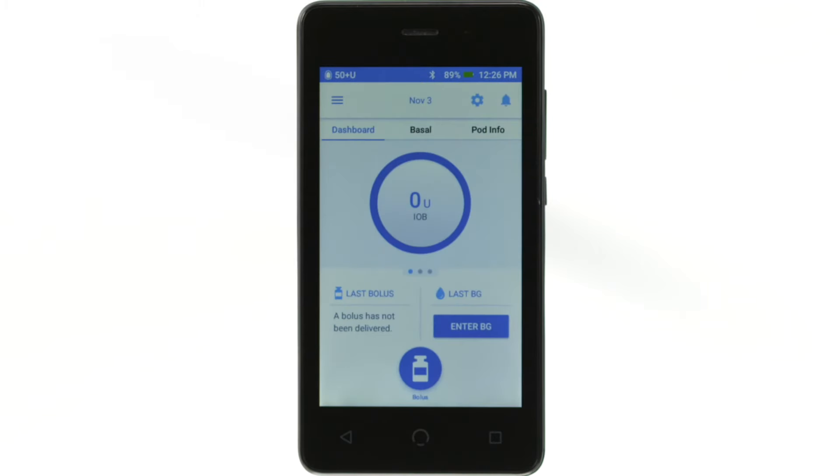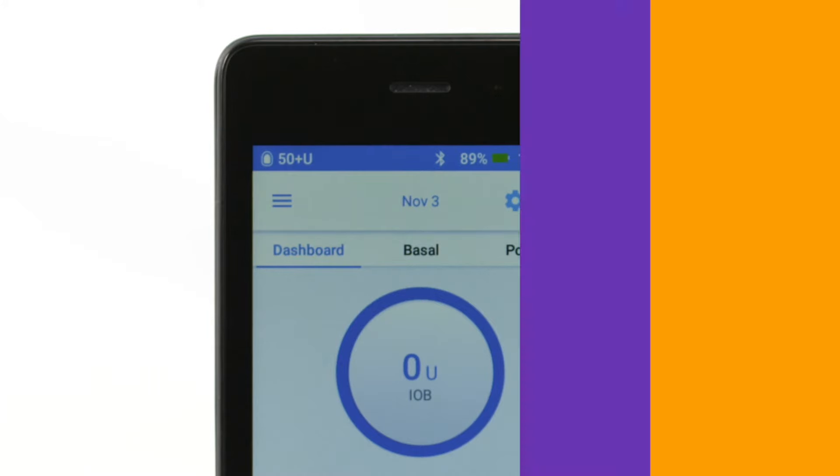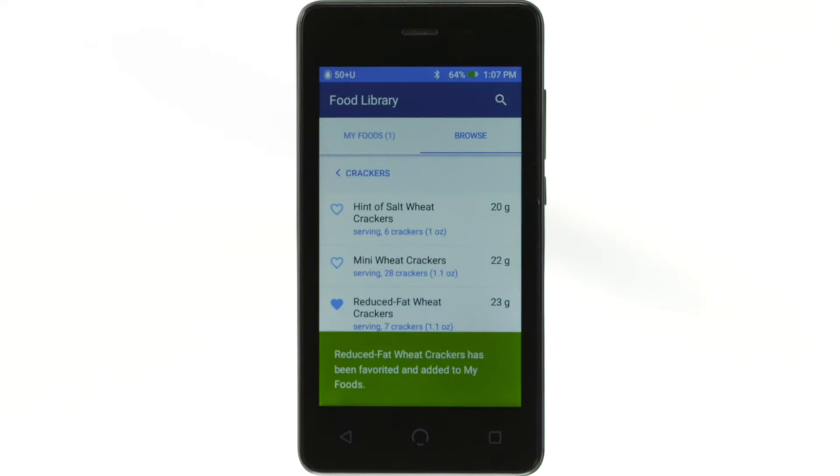The status bar at the top of the screen will display information about the volume of insulin in your pod, as well as your PDM's battery charge. During use, the PDM will also display confirmation messages with a green banner at the bottom of the screen. It will disappear after five seconds, but you can swipe the banner to the right to dismiss it earlier.